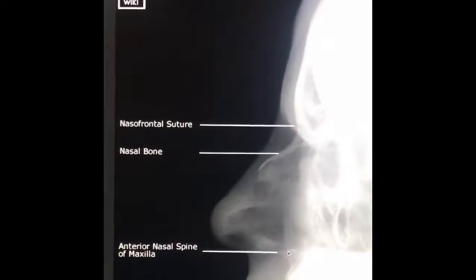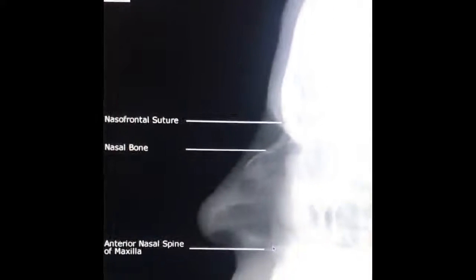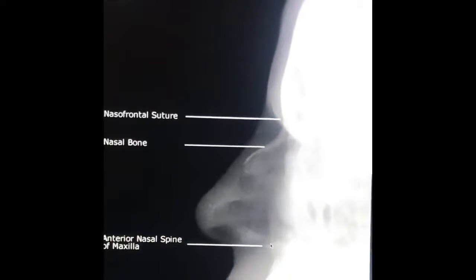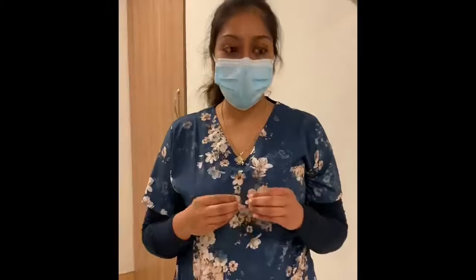Your medical legal requirements are as we mentioned previously. Also, if you could please go through your tangential or superior inferior view. It's in your Bontrager, and I think you'll also find it online. So now that we're done with nasal bones, we're going to move on to your zygomatic arches.